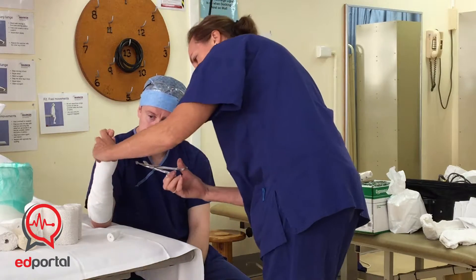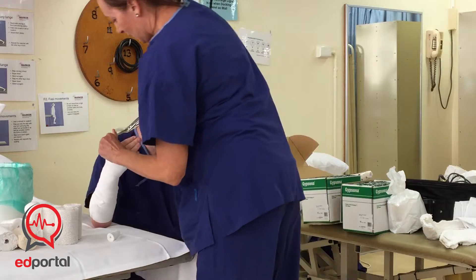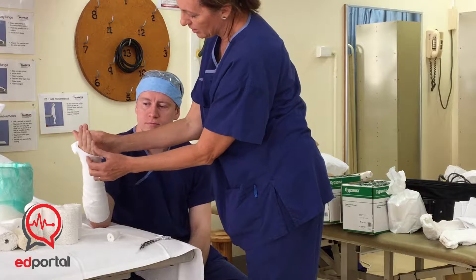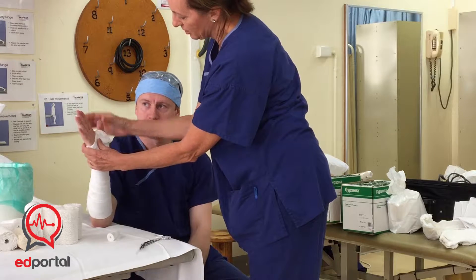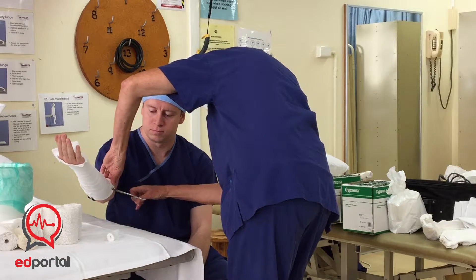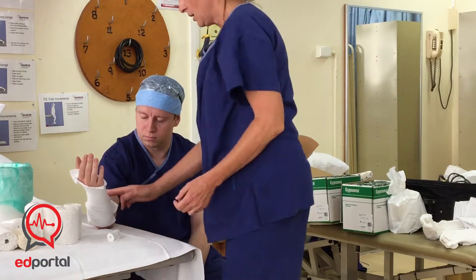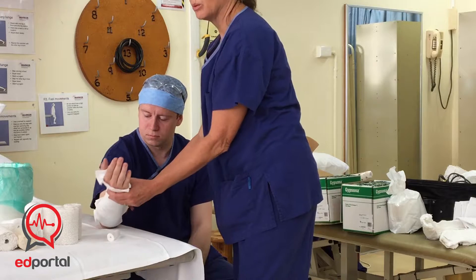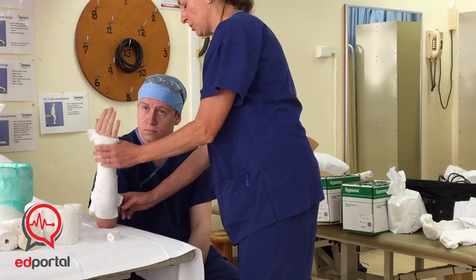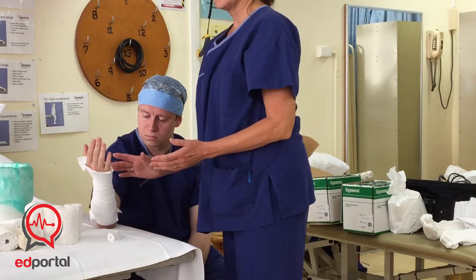Now you've got to cut your parameters in. The top one — the top diameter — is the palm crease. Just cut that and check it's in the right spot for the patient. The bottom one is about two fingers from the elbow. You can also fold that back. That'll vary — if someone is quite overweight, you'll need to pull that back a bit further because you want them to be able to bend their arm without the plaster cast cutting in.